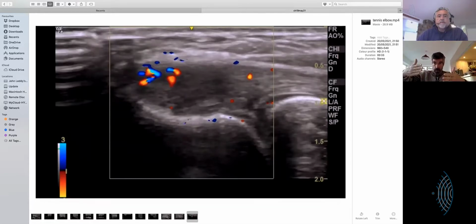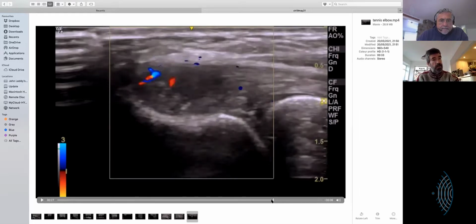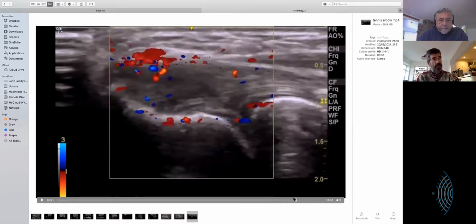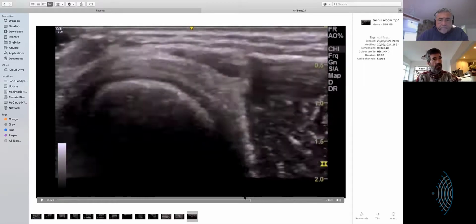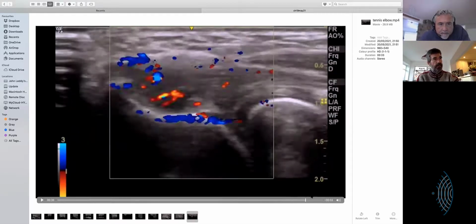These are the ones in this sort of folding book appearance, and then it masses up and swells up. If you can scan those fibers, your scanner's probably going to struggle to get the detail. It hasn't quite got the frequency range or the spatial resolution for that.